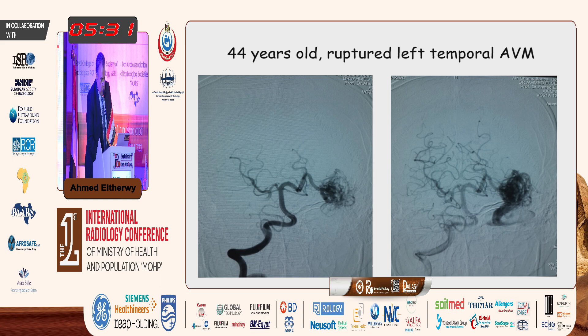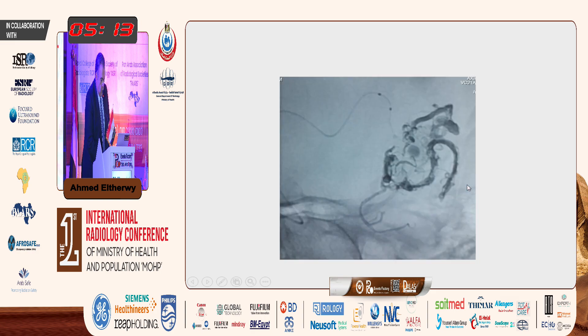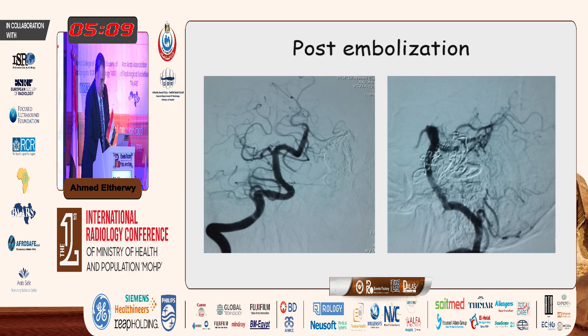This is a 44-year-old with a ruptured left temporal AVM supplied by temporal branches of the PCA. Here we can see the four markers: the distal tip of the Sonic, the tip of the magic, and the detachment marker for the Sonic. Here we can see glue injected, and then you can go forward with injecting onyx until obtaining a complete cure for this AVM.